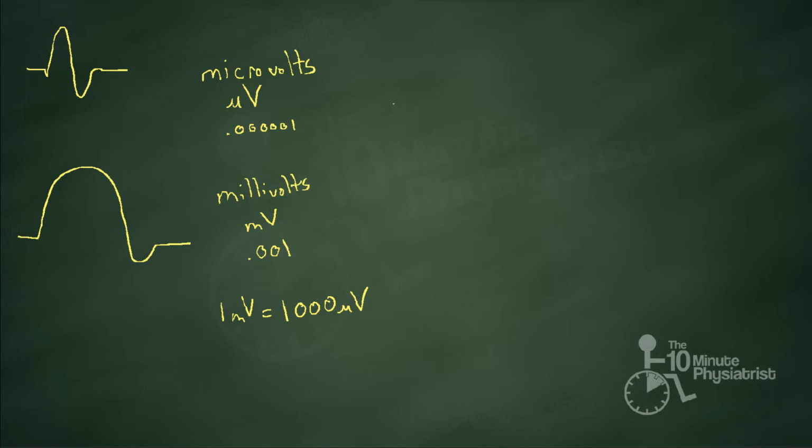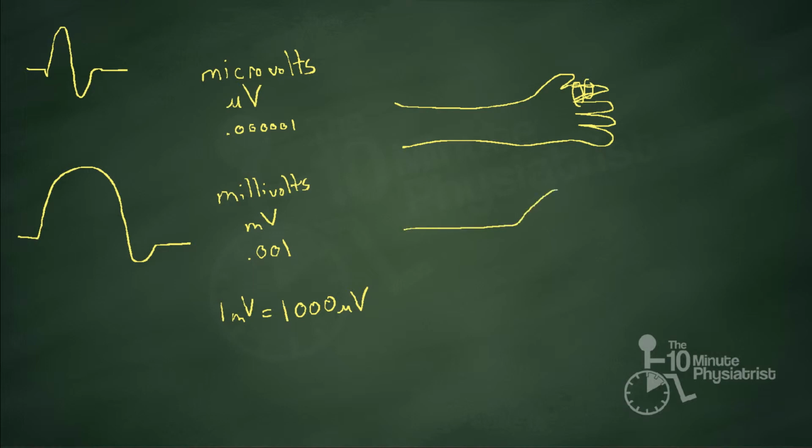The reason for that is probably obvious to all of you. And I learned this technique from Frank Netter. In a sensory nerve potential, we are measuring the action potential, or the depolarization, of this tiny digital nerve by the ring electrodes on the finger. Very, very small structure, very small electrical generator.